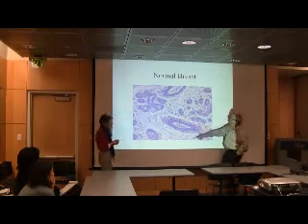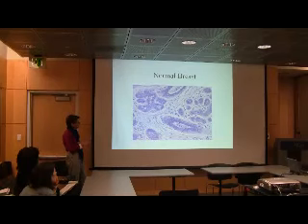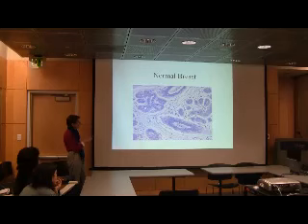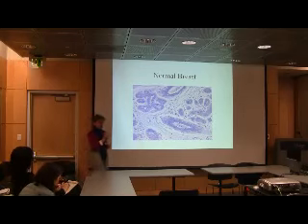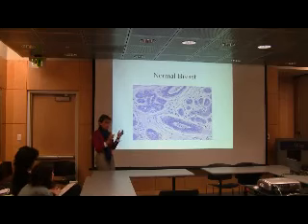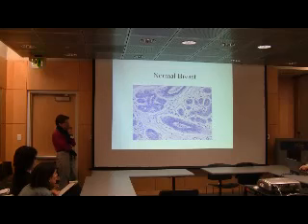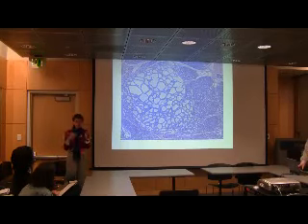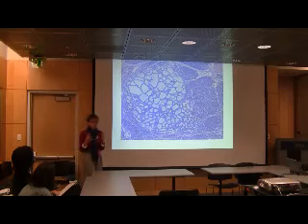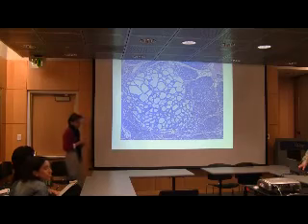I have a better picture, and we'll be coming to it in a minute. But that's true for the lobules: they have two layers of cells, and there should be a little bit of an opening in the center of these structures. That is normal. If it's not there, then something is going on that's not totally normal, and we'll look at that as we go forward. There will be a lot more of this. And the other thing is that there's lots of variability, and I'll show you some more examples of what's normal. They don't all look exactly the same, because there is variability between people.